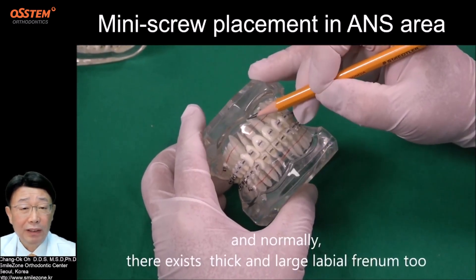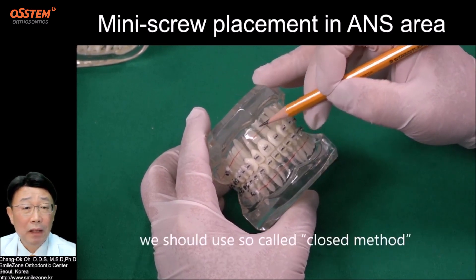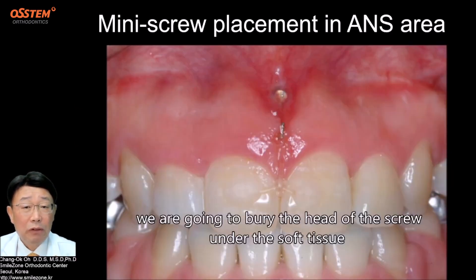Normally there is also thick and large labiofrenulum. We should use the so-called closed method, where we are going to bury the head of the screw under the soft tissue.